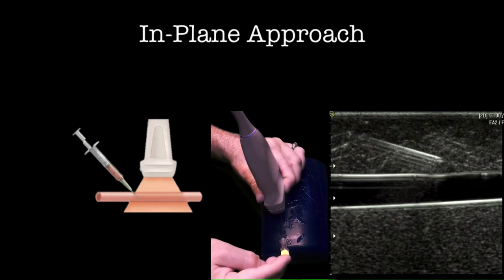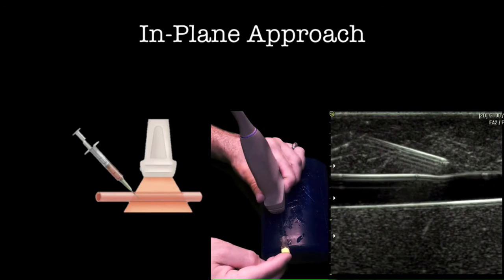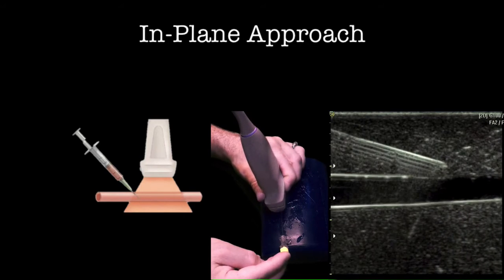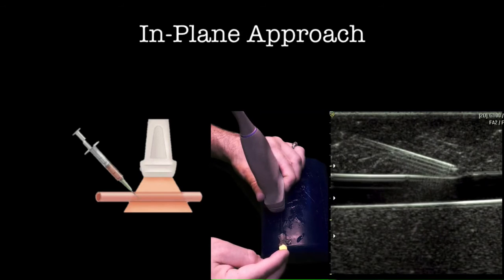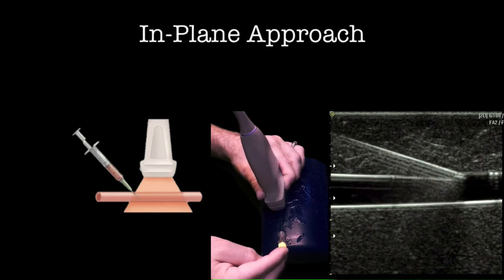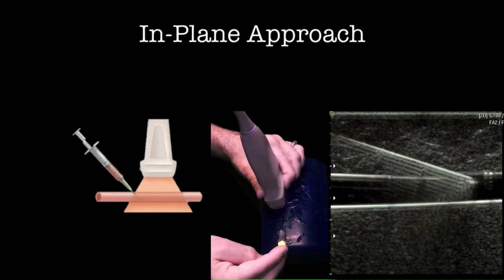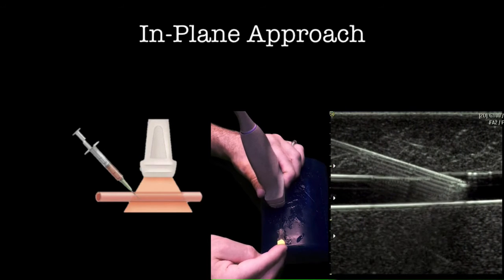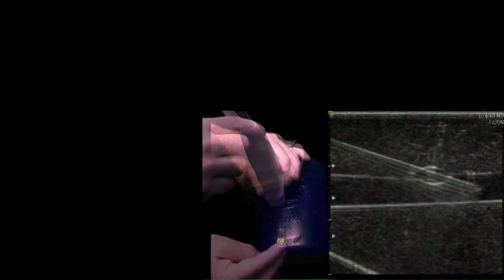When all three structures—the transducer, the needle, and the vein—are lined up, the needle tip can easily be seen entering the anterior wall of the vein and not puncturing the posterior wall. This technique is thought to be safer as posterior wall penetrations occur less frequently since the needle is seen in its entirety.